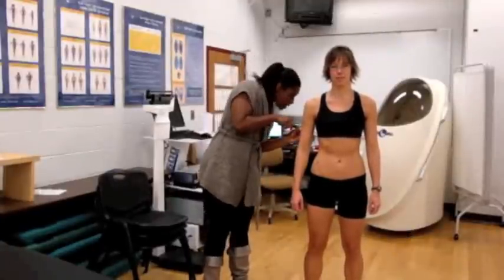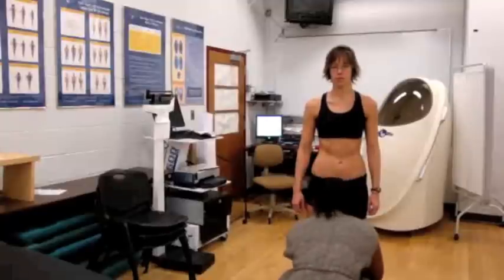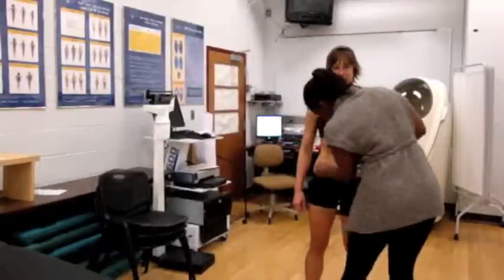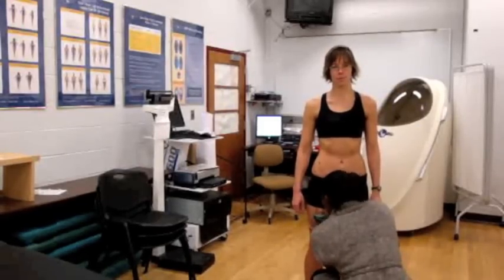Repeat the procedure three times as the measurements may vary. Record the average of the measurements. Add the results of each measurement to get a total value in millimeters and then input the measurements into the specific equation. Make sure to review the equation prior to measuring your patient.